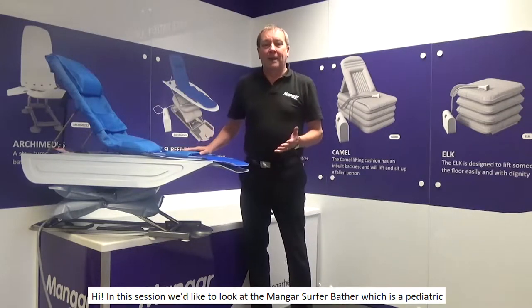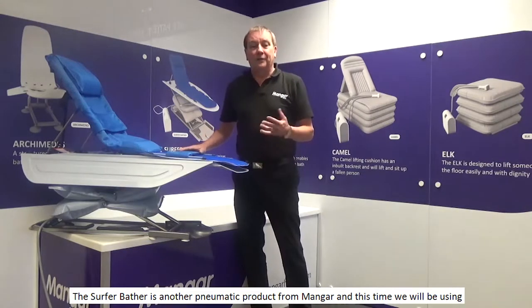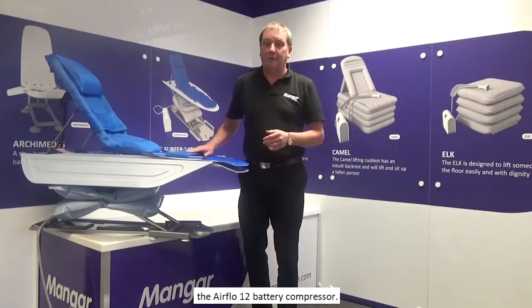In this session we'd like to look at the Mangar Surfer Bather, which is a paediatric or children's bath lift. The Surfer Bather is another pneumatic product from Mangar, and this time we will be using the Airflow 12 battery compressor.